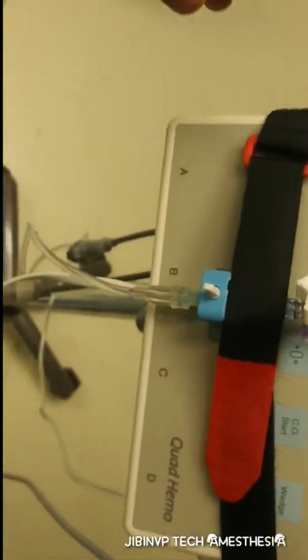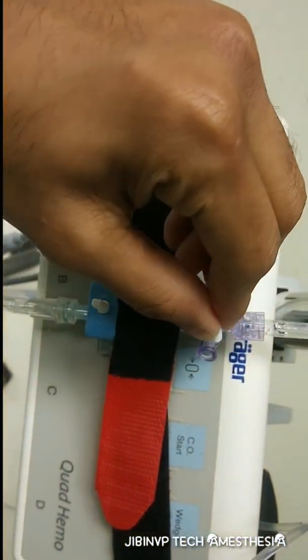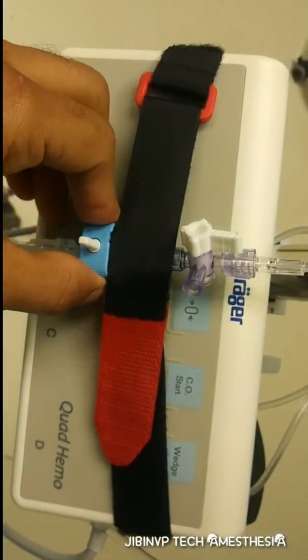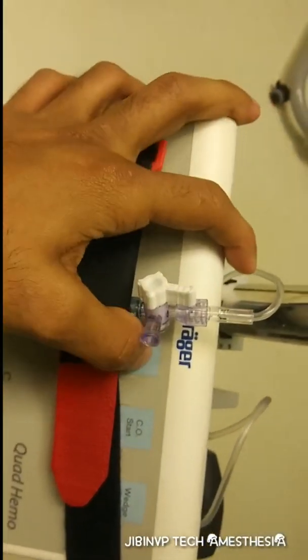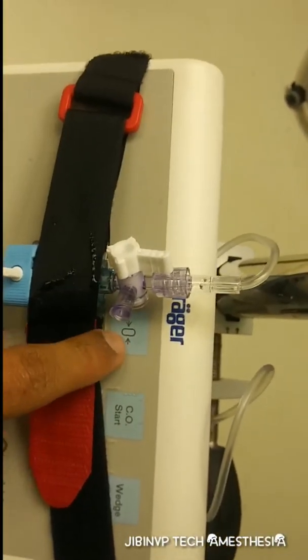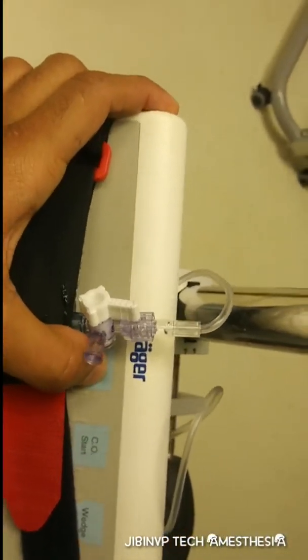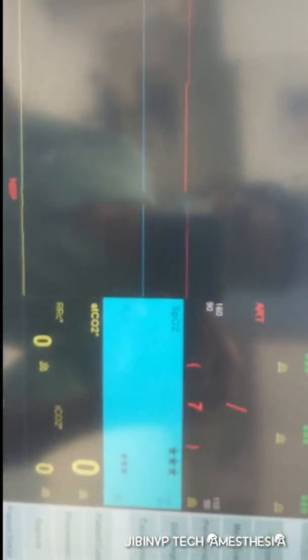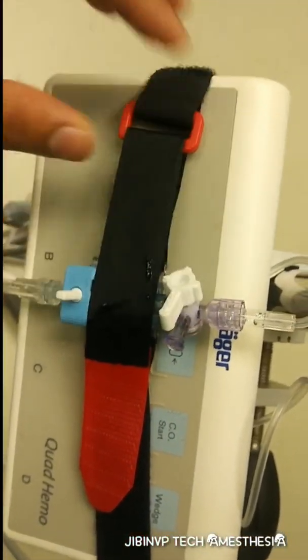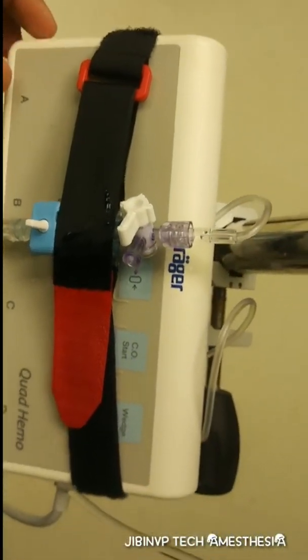To perform zeroing: first close the patient end, then flush it, and then select the zeroing option — the zeroing option is available here. Zeroing is now completed. We can put it back in-line.